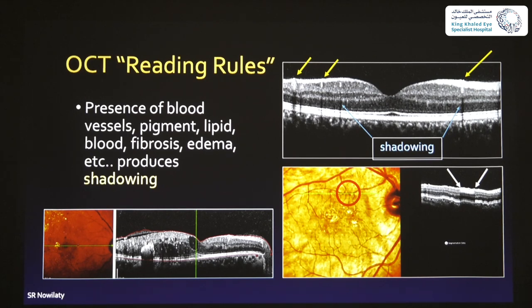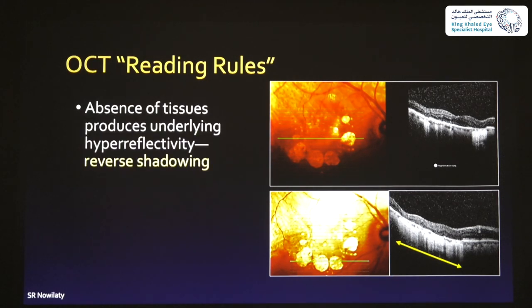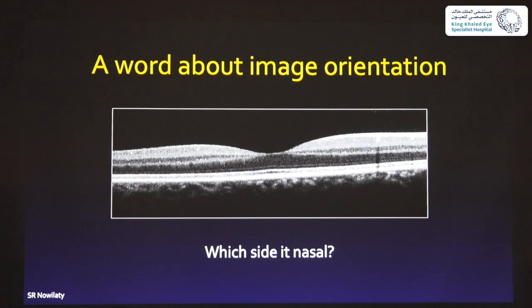Retinal vessels are hyper-reflective and cast shadows that go all the way through — you can see this clearly. A vessel oriented horizontally across the scan gives a horizontal hyper-reflective area with shadowing behind it. Lipid deposits in the outer plexiform layer also shadow posteriorly. Conversely, if there is absence of tissue — such as laser scars or geographic atrophy — this produces underlying hyper-reflectivity, which we call inverse shadowing or transmission enhancement.